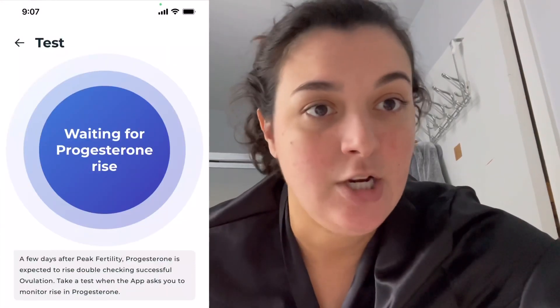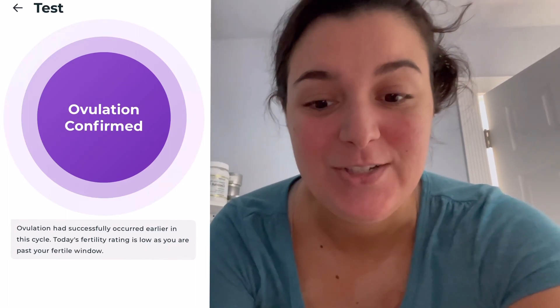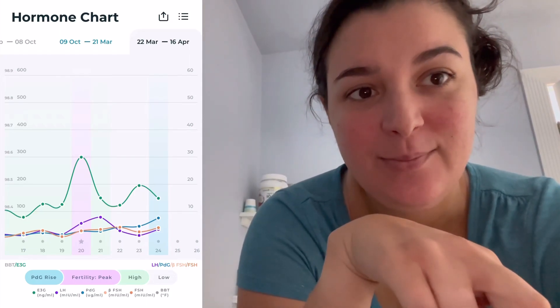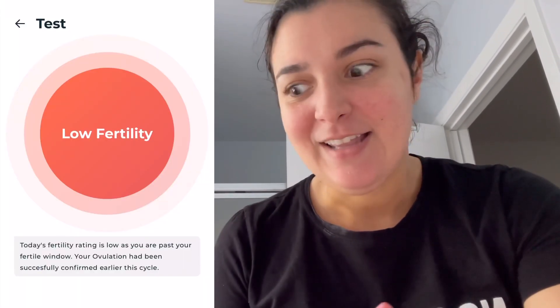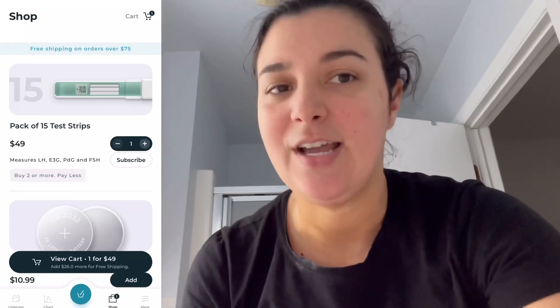We still haven't confirmed ovulation yet — it's saying it's waiting for the progesterone to rise, so I'm hoping that comes in the next day or so. My ovulation is finally confirmed, which I think is just so cool. I was worried I wasn't going to get the rise in the PDG but it finally happened. I just finished my last test for the month. We're back to low fertility and this whole thing has been really cool to see every day. I'm definitely going to order more tests because I want to do this again next month. To order more tests you do it right in the app, and it was already telling me I was running out.